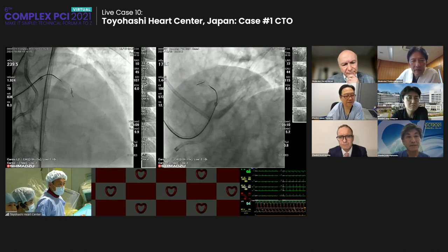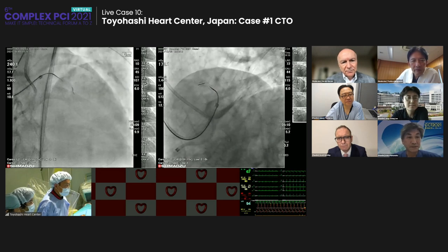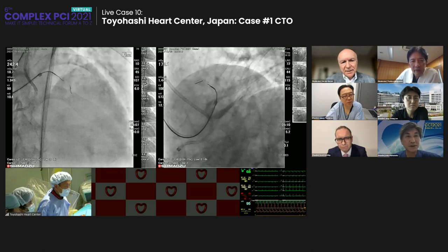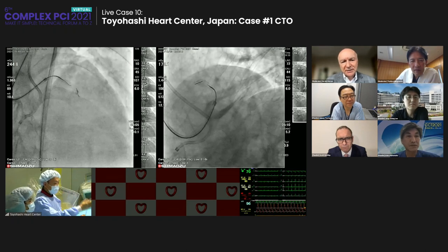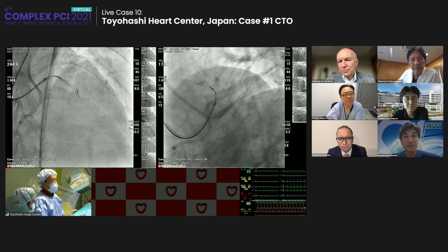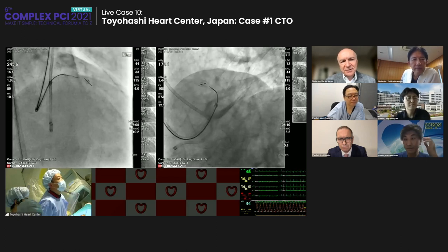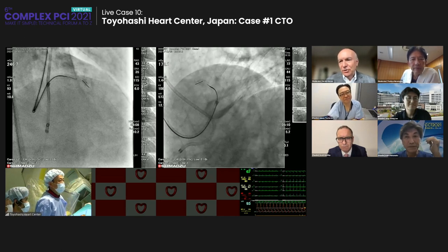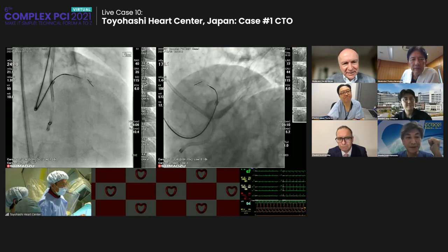So maybe in both, Andrew, the wire is located in the center of the stent. That is not a bad situation. And also the wire rotates freely. Yes, freely. Nice. I think this is certainly an occlusion in a not so long stent, but I think the future that we will have is more secondary occlusion because of atherosclerosis. These will be stiff or tight and hard stenoses. In fact, I did not only use a filter wire, but two days ago I had two stent occlusions that were 10 years old. And then you have calcium inside, but here it doesn't look like calcium inside.